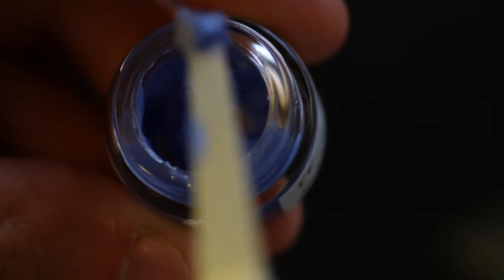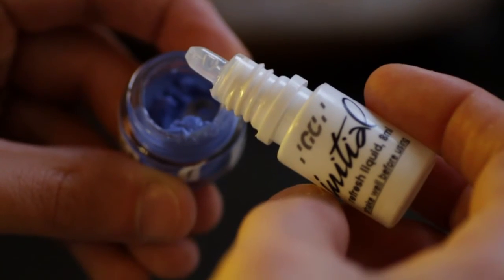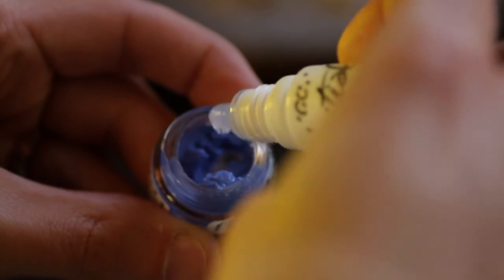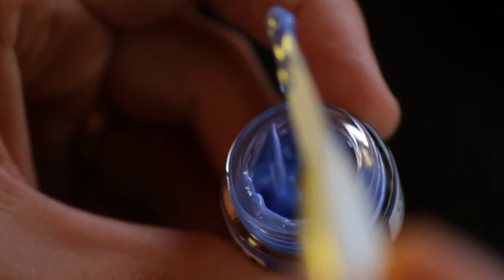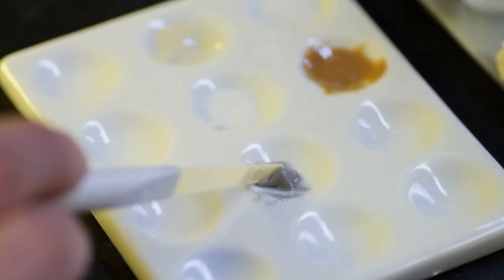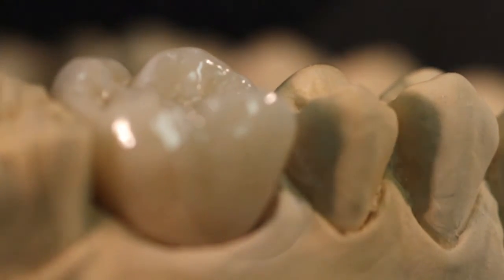Lustre Paste Refreshing Liquid: the Refreshing Liquid is used to preserve the thixotropic property of the paste and to recover dried-out paste to an optimum gel-like consistency. The Refreshing Liquid can be used both in the jars and mixed on a separate plate. Please see the Initial IQ Lustre Paste NF Manual for more detail.